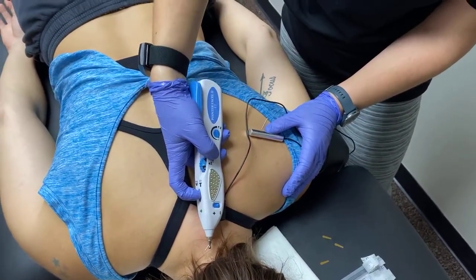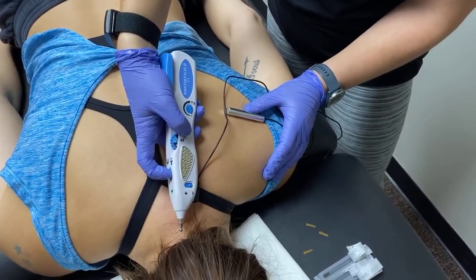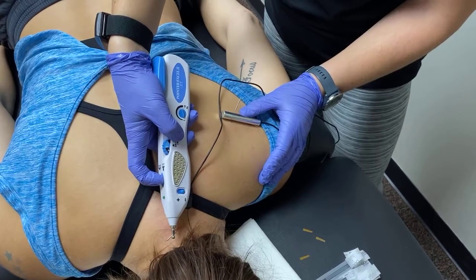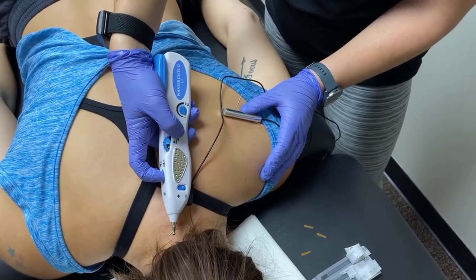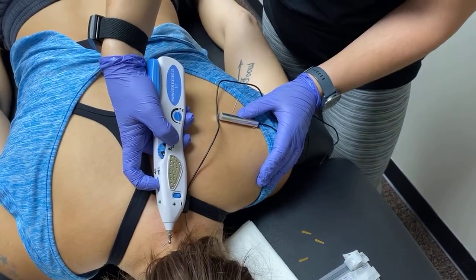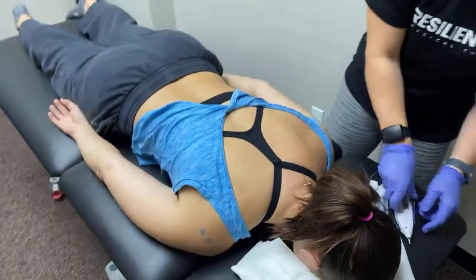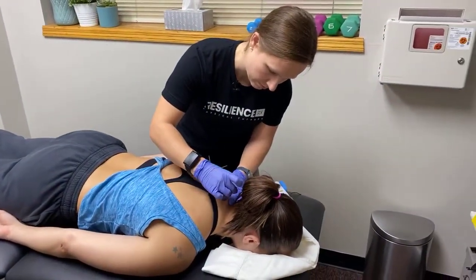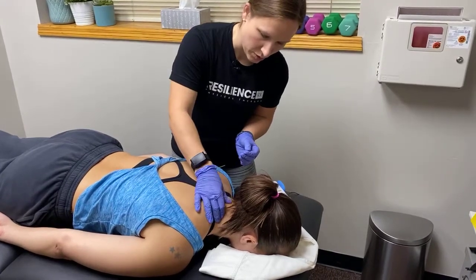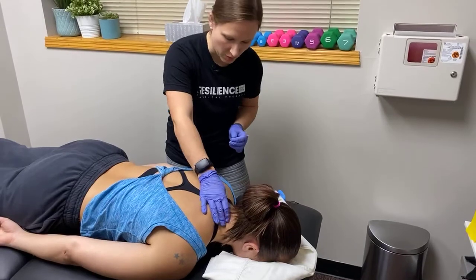Did the intensity change at all for you? No. Okay. Sometimes the intensity will increase, sometimes it'll decrease, and sometimes it stays the same. Depending on what it does, it's not good or bad, it just is. Let me just go ahead and take them out. A little bit of input afterwards helps with some soreness that may occur.